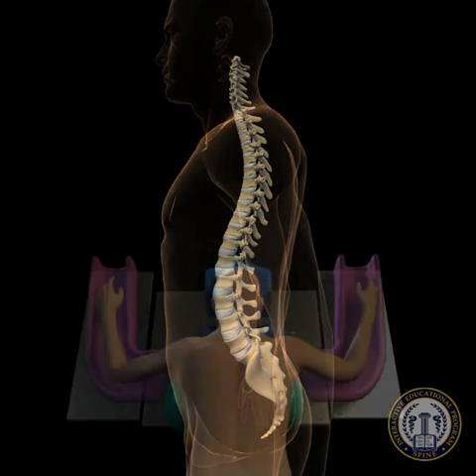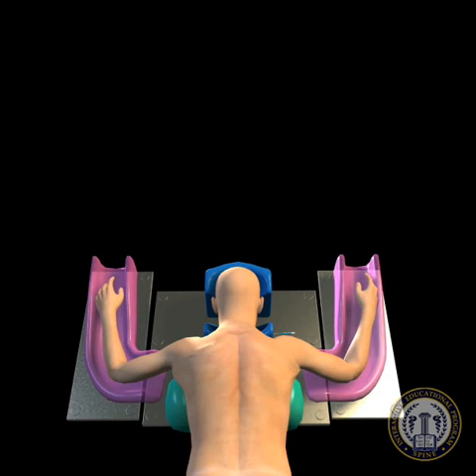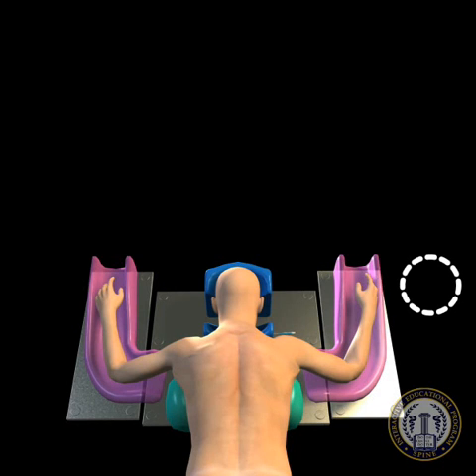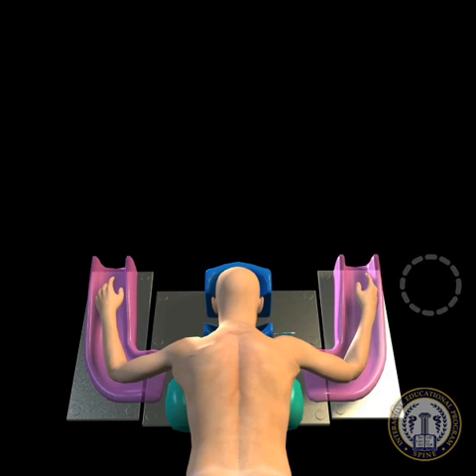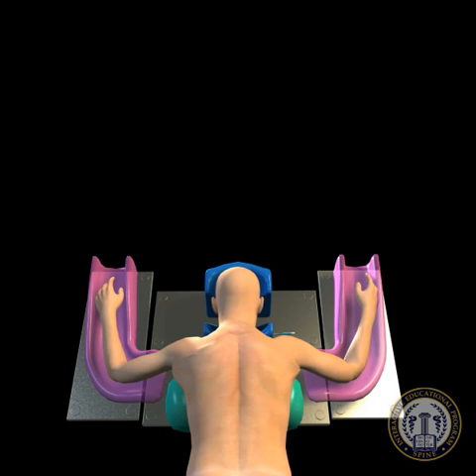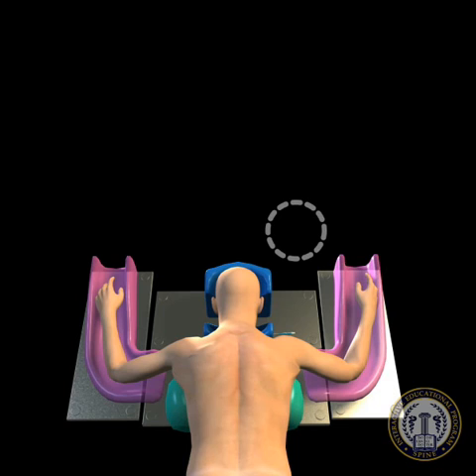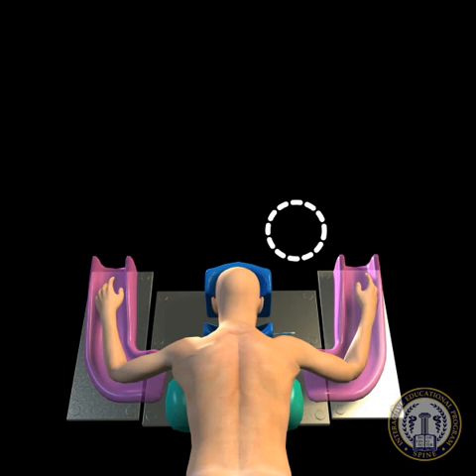The attachment of the minimal access retractor device is placed on the side opposite the planned side for the TLIF, as cranially as possible to minimize obstruction to the surgeon and the fluoroscopes. Neuromonitoring with spontaneous EMGs and somatosensory evoked potentials is set up at the head of the table next to anesthesia.